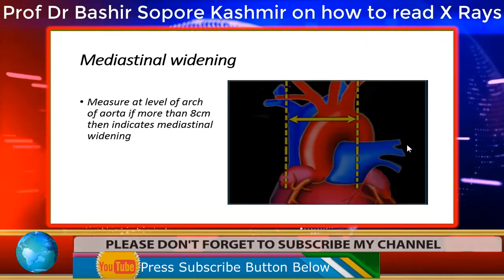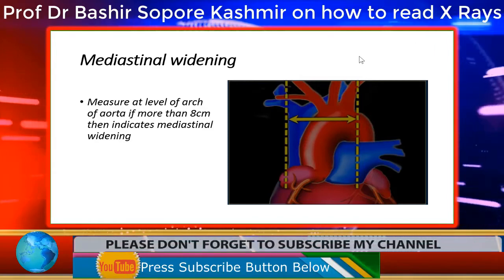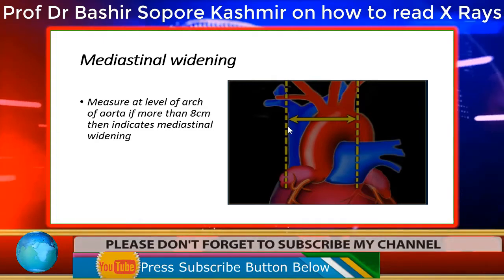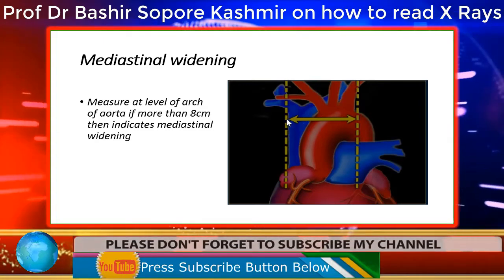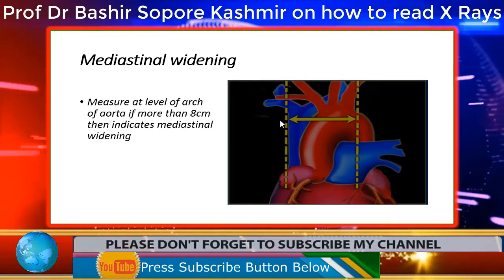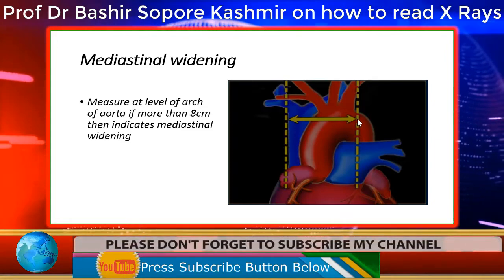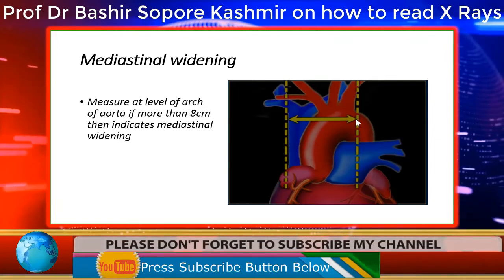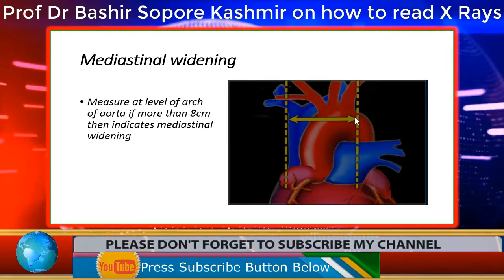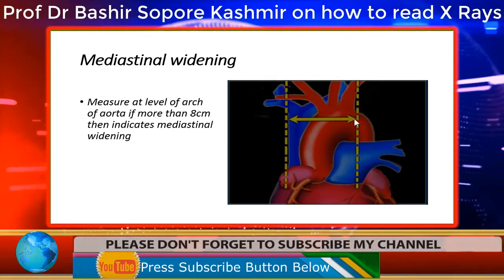Now talking about the mediastinal widening. To speak about the mediastinal widening, we have to measure at the level of the aortic arch, as shown in this image. And if you find that the mediastinum at the level of the aortic arch is more than 8 centimeters, then we say there is mediastinal widening, right?